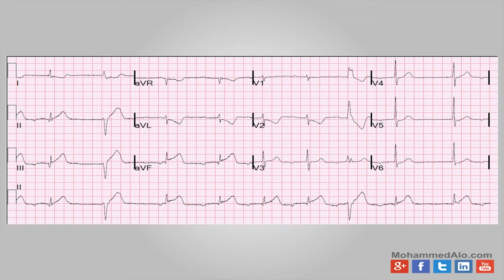The PVC throws it off since you only have 1 beat to look at. But when you look at AVF, it's elevated. Both the beats in AVF are elevated. In lead 3, you can't tell because there's just 1 beat. But even that 1 beat has a pretty wide Q wave as well as the elevation. So this is your basic inferior posterior MI, RV involvement, RV infarct, treated as such.